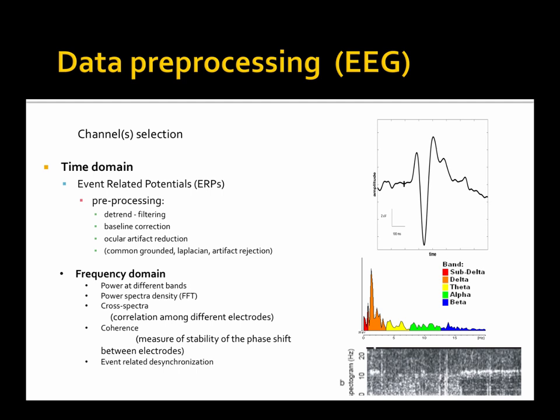So regardless of the time, when we do the pre-processing of the data for the EEG, it is fairly similar to what you will do in a regular EEG experiment. You may want to do it in a few channels at a time, depending on what strategy you're using, just to speed up the processing. The more data you try to process, the longer it will take. Of course, with EEG, the data is collected pretty quickly, and some of the operations are fast, so it won't affect much, but still you may want to reduce the amount of operations.